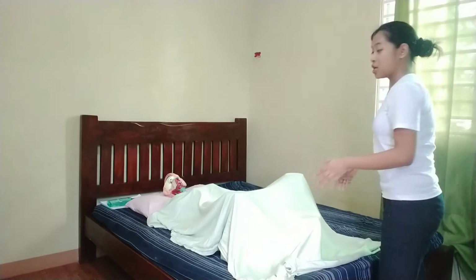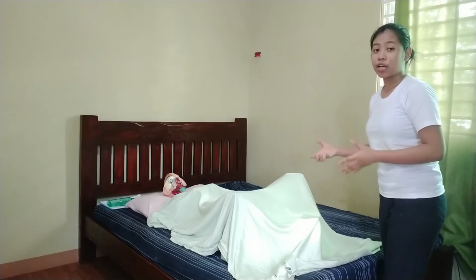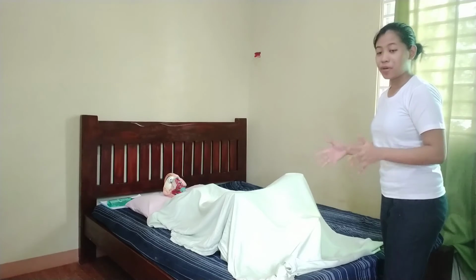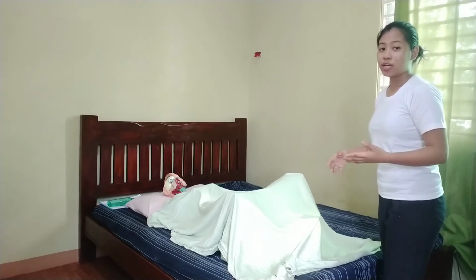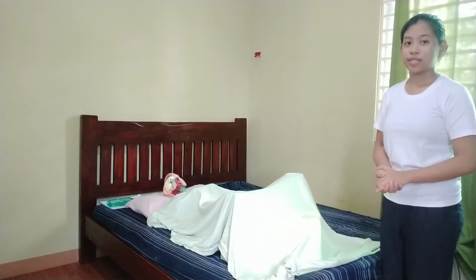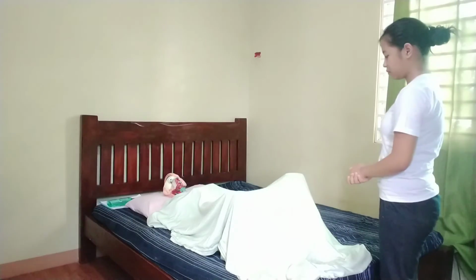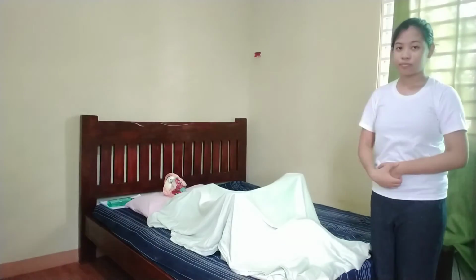When doing the Perilite exposure, it is important to assess and check the patient regularly, every 5 minutes during the procedure. This is to assess whether the patient is having any untoward reactions, burning, or discomfort. So let us wait for 5 minutes. You can check now. Everything's good. Again now. Okay. Can you check again now?